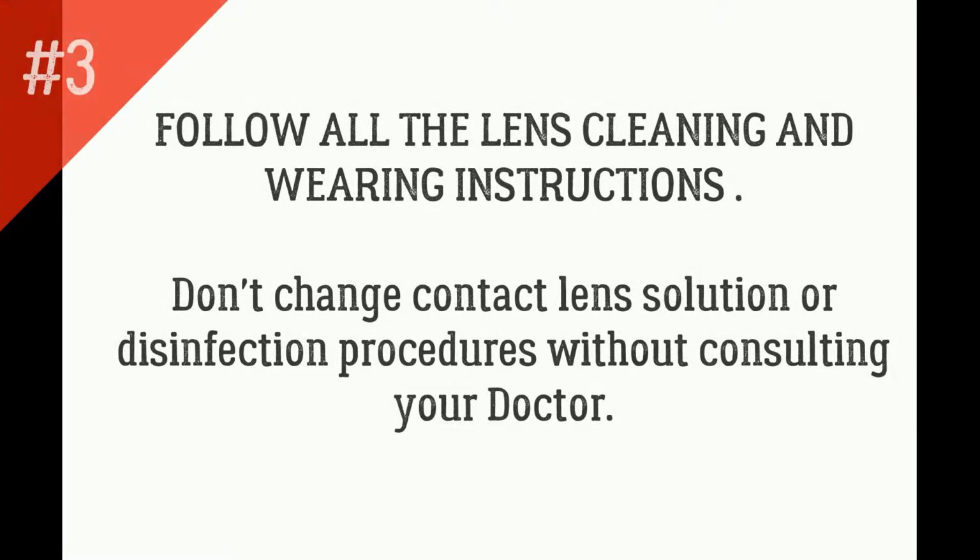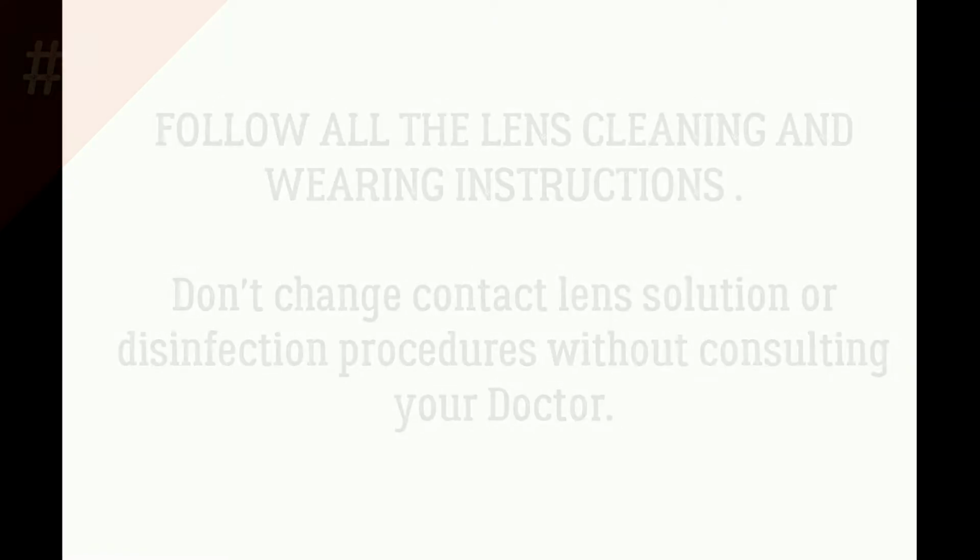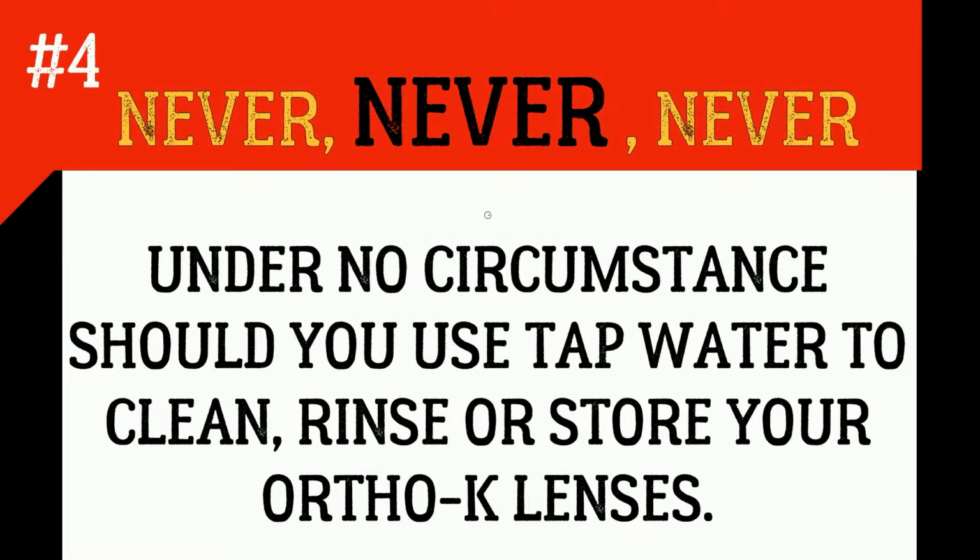Follow all your lens cleaning and wearing instructions. Don't change contact lens solutions or disinfecting procedures without consulting your doctor. And never, under no circumstance, should you use tap water to clean, rinse, or store your Ortho-K lenses.